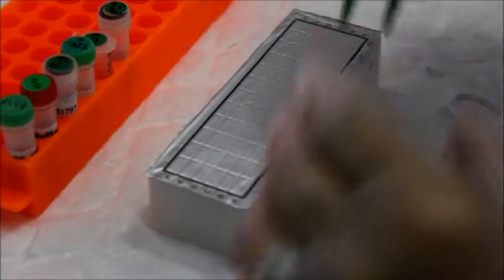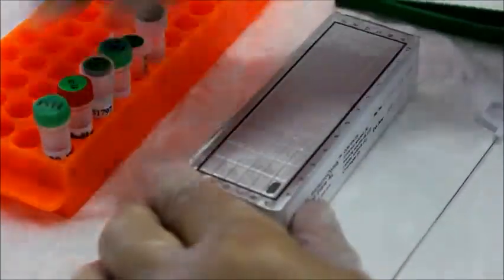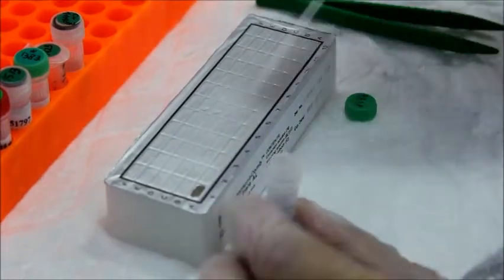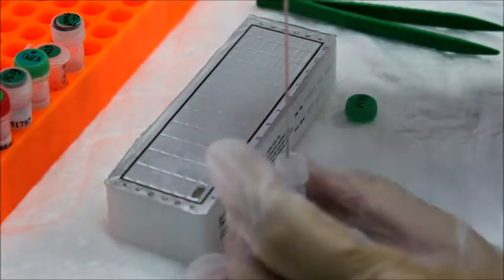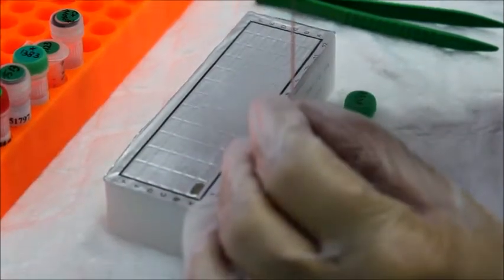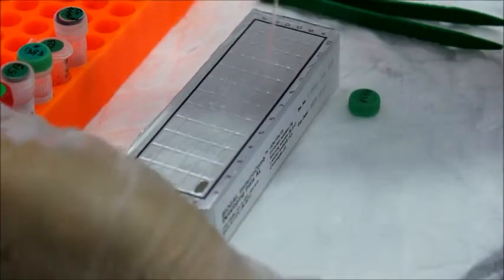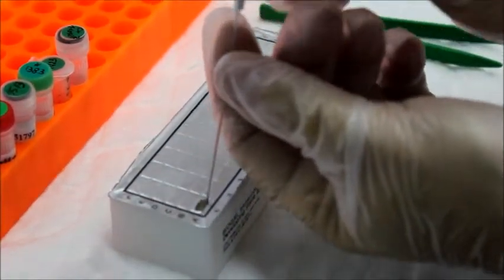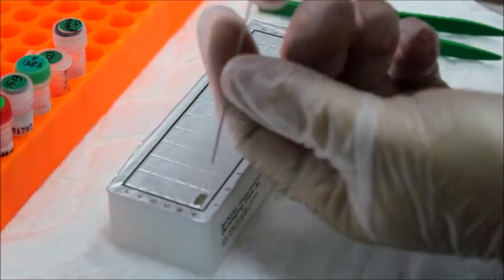Use the tweezers to pierce the protective aluminium cover of row A, 1 well for each specimen. Deposit a sample into a well in row A. Raise and lower the pipette or piston plunger several times to achieve fine and well mixing. Do not open any well of row A or other rows which you do not intend to use.